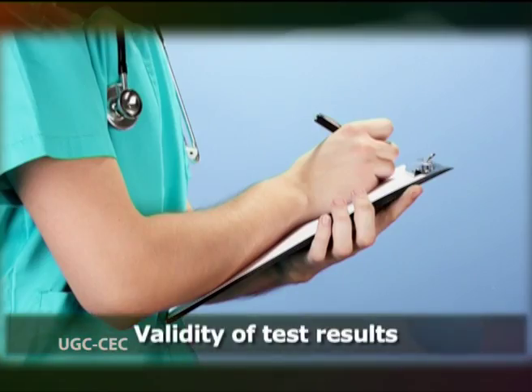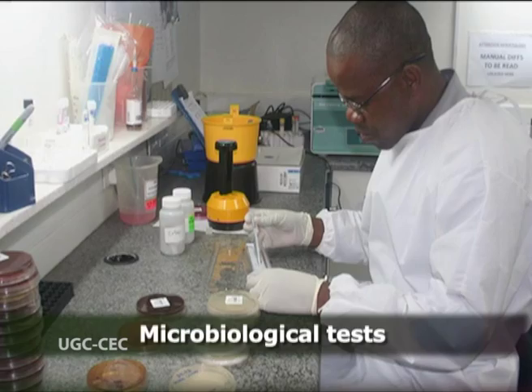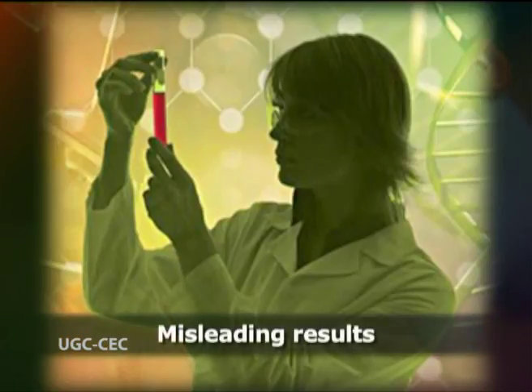The validity of test results largely depends on good practice in the pre-test stage, and it is essential that documentation is accurate and comprehensive. Microbiological tests are not as standardized as some other laboratory tests. The ways in which a sample is processed and the results are interpreted depend heavily on the information provided with the specimen.